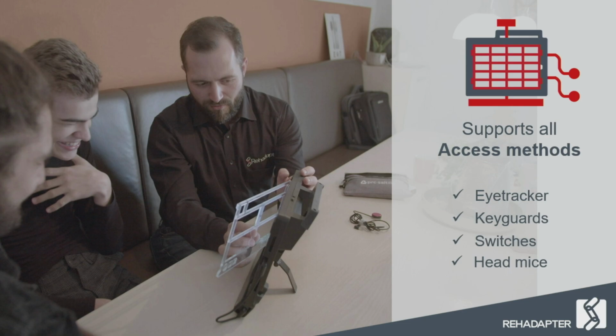The keyguard system is positioned here with 4 rubberized elements on the front frame that are always included in every Rehadapter. You can choose between 3 different strengths of pressure, depending on how easy or how difficult it should be to get the keyguard inside or to release it. At the moment, a medium strength of these rubberized elements is already pre-installed. So if you want to get the keyguards in and out, you just press a little bit against the rubberized inlays and get the keyguards in and out.